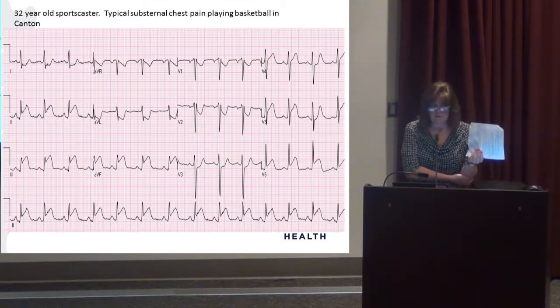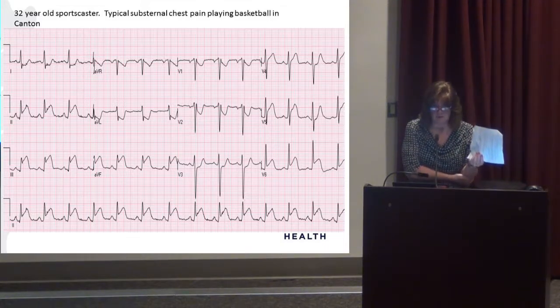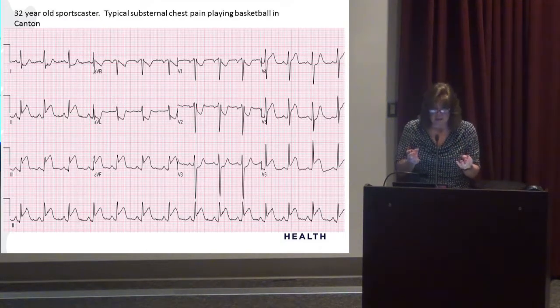Okay, and how can we confirm that? What are the anterior leads doing? What kind of mirror or reciprocal changes do we see anteriorly? Right, inversions, ST depression, those are signs of ischemia. So yeah, you've got a big MI in the inferior lateral region, but you have ischemia in the anterior region. So like the infarct is not getting any blood at all, and the other vessels are like barely getting blood, and they're ischemic, and they're crying for oxygen. So you've got a couple things going on here, and this is a big MI.